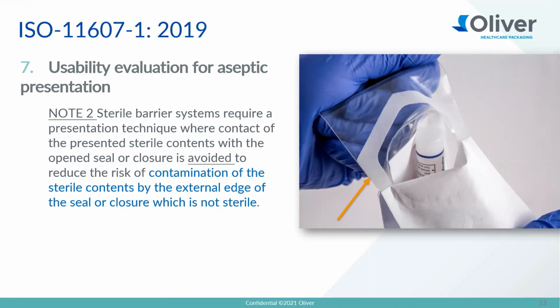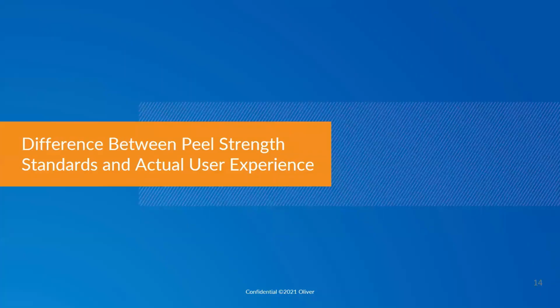Agreed. And some of that training entails things like techniques of knuckle peeling and then a continuous peel from there, different ways to present a product. So it is really important that nurses understand what the open features are and intended to do, and they are consistently trained and taught. Yeah, thanks, Jeff, for that insight.